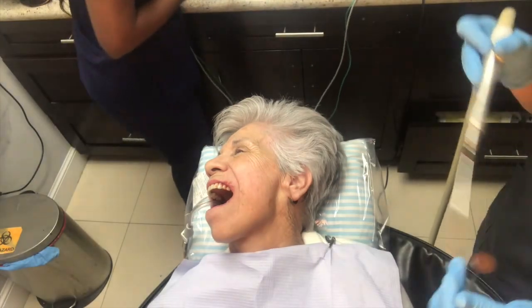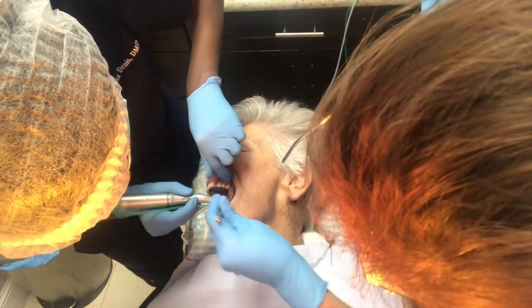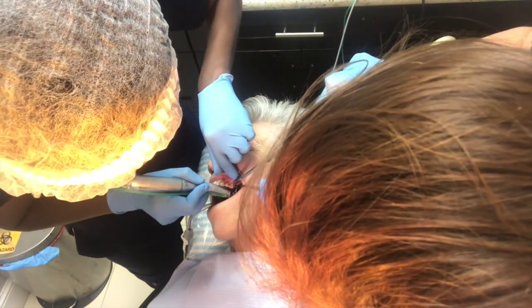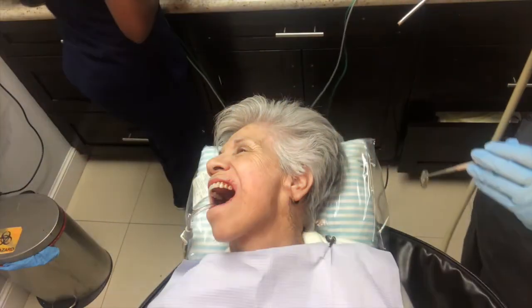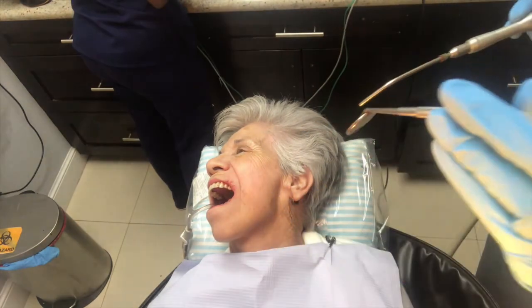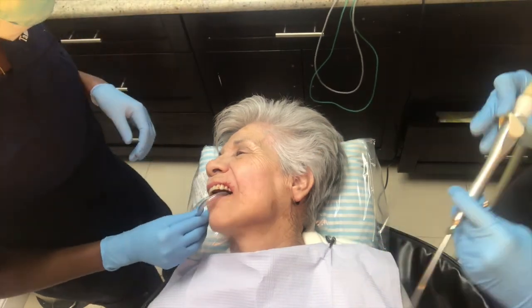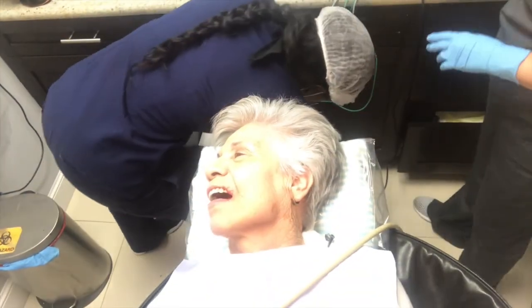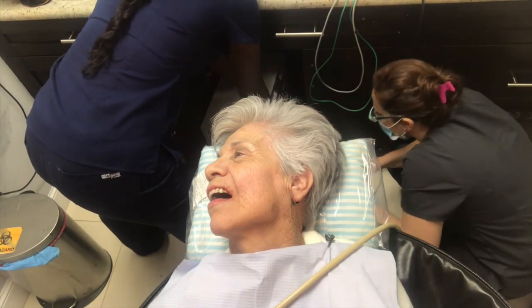But the first thing you're going to see me do, I've already opened up a flap, and if you're curious to see what that looks like, check out my video of my own dental implant being done. We open up a square in the gum, we call it a flap, and after we've done that we push the gums back and then we use a drill that creates a small hole that little by little becomes a bigger hole. We call that an osteotomy. So we go in there with something called a 1.8 millimeter pilot drill. After the pilot drill, we'll go to a 2.2 millimeter drill, and then we'll keep going until we eventually reach the size and depth of the implant that you want.